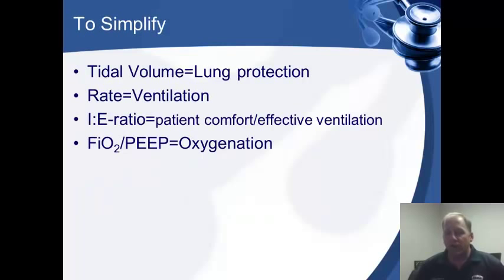I want to simplify some terms for you. When we talk about tidal volume, I want you to think of that as lung protection. Tidal volume doesn't really change that much just because of what's wrong with us. So if you set a tidal volume, it's probably not going to modify very much. You want to set a rate because that equals ventilation, and an increased rate, decreased rate, however you set it, it's basically going to be modifying your end tidal CO2.